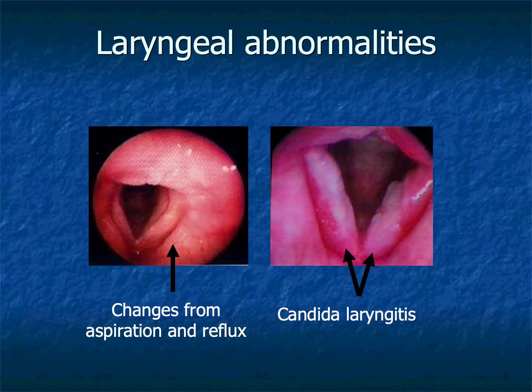Here we see laryngeal changes associated with aspiration, reflux, and candidolaryngitis. The airway is constantly influenced by processes occurring outside the airway itself. Gastroesophageal reflux, swallowing dysfunction, chronic aspiration, medications, infection, and systemic illnesses all leave visible traces on mucosal surfaces. Bronchoscopy, therefore, is not only an examination of anatomy, but also an examination of physiology and disease interaction.